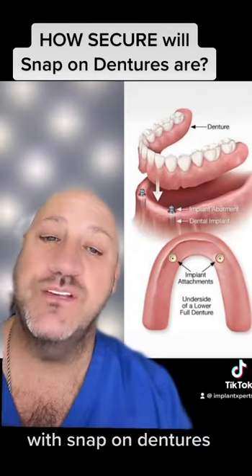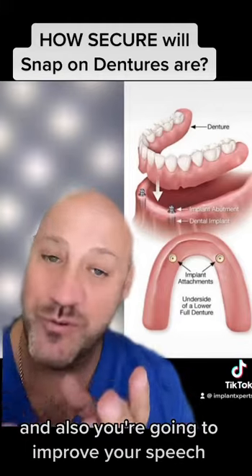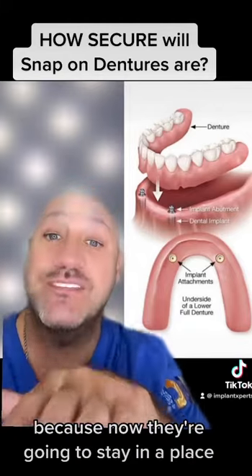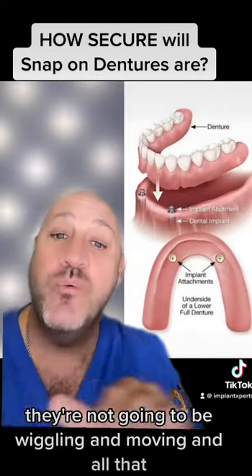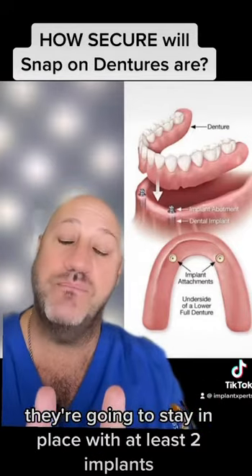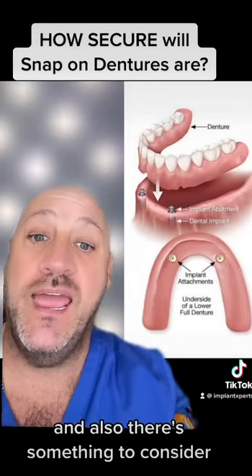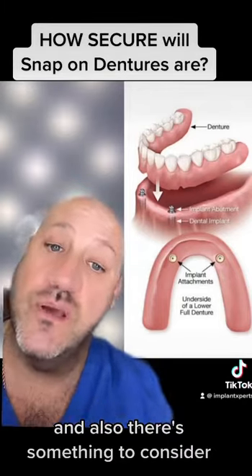With snap-on dentures you're going to improve your aesthetics and also your speech, because now they're going to stay in place. They're not going to be wiggling and moving — they're going to stay in place with at least two implants. That's one of the things you can certainly improve with this.